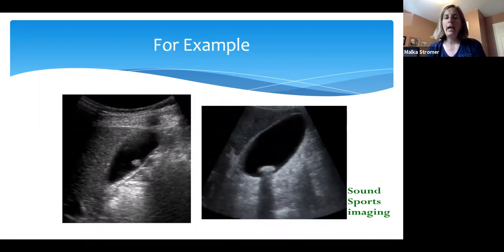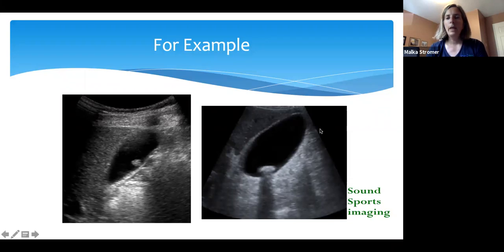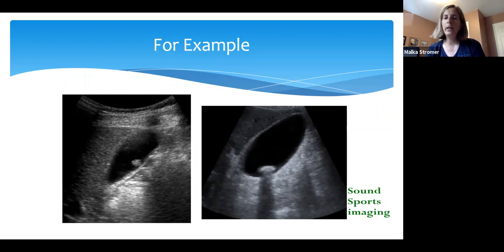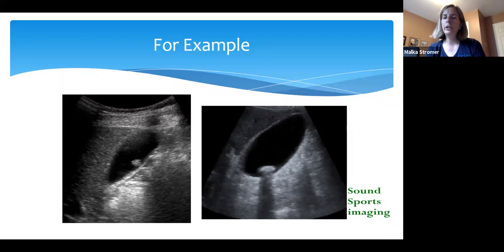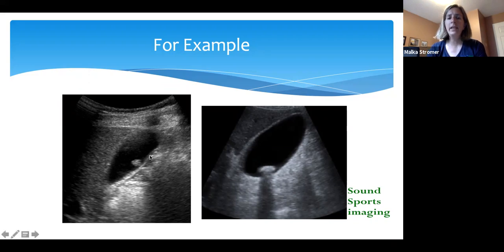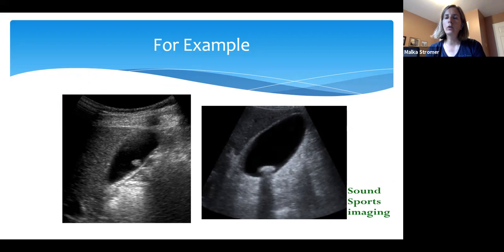Looking at two different gallbladders — both have anechoic lumens with echogenic structures within them. One echogenic structure has posterior shadowing; the other does not. The posterior shadowing helps us determine that the structure in that gallbladder is rock hard and solid. Another helpful tool is moving the patient — if we move the patient, the rock-hard structure with shadowing also moves, which is characteristic of a gallstone. The structure without shadowing is not rock hard, and when we move the patient, it does not move. That is characteristic of a gallbladder polyp that grows from the wall of the gallbladder.